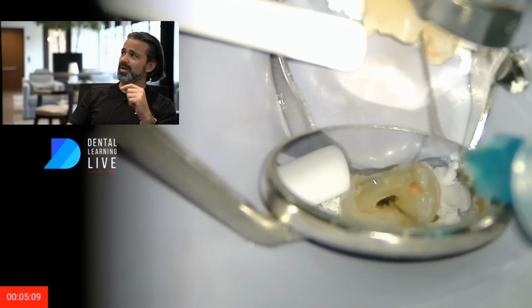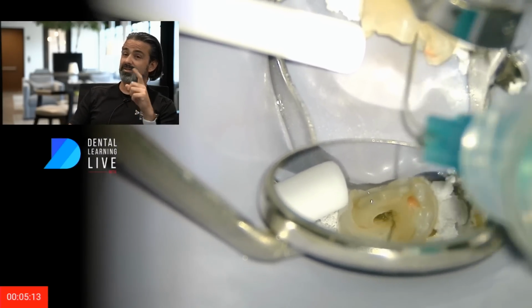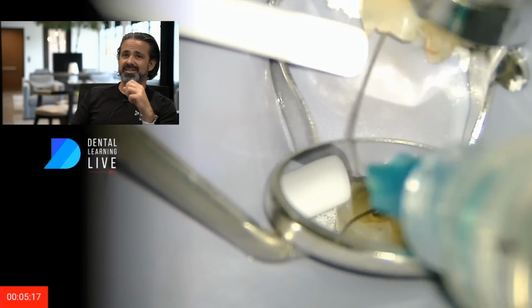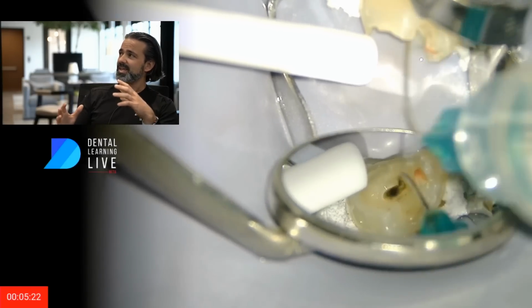But I don't quite know what it is. It feels like there's a stone or something down there. So, to be continued on that, we'll investigate it. I'm flushing basically so I can visualize where the fork is as much as I can.